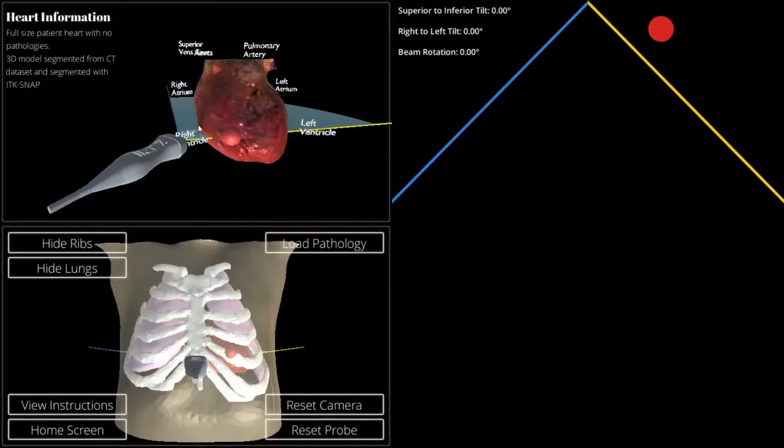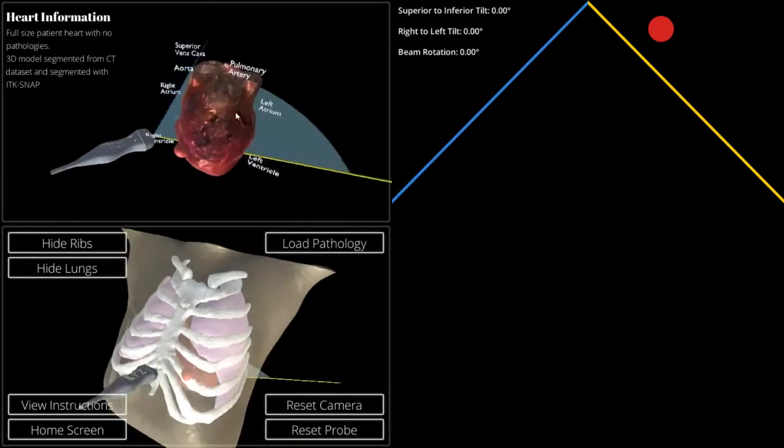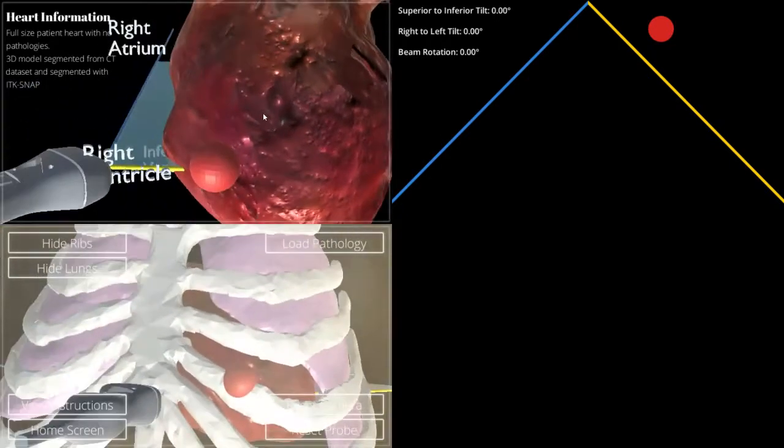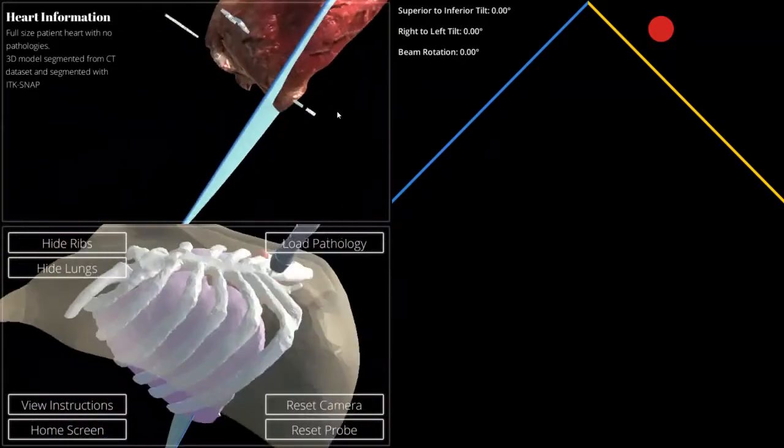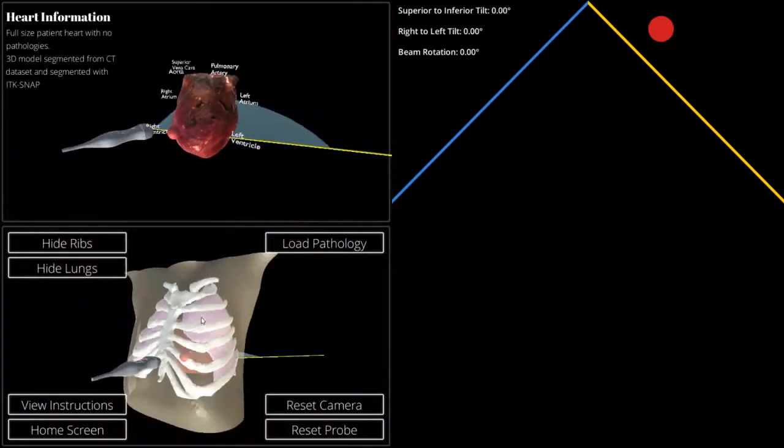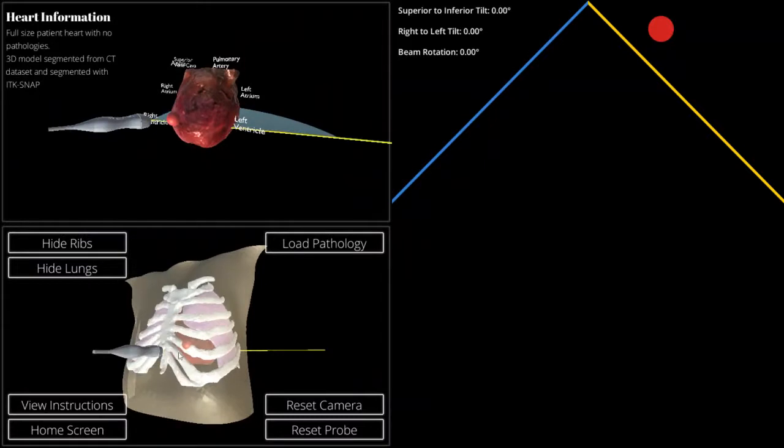The first scene that we're greeted with is a normal patient's heart. In this top view, we can see the different anatomical features at least on the surface, so that you always know where you are. On the bottom view is where you're doing the positioning between the ribs, the lungs, the heart, and the person's chest.